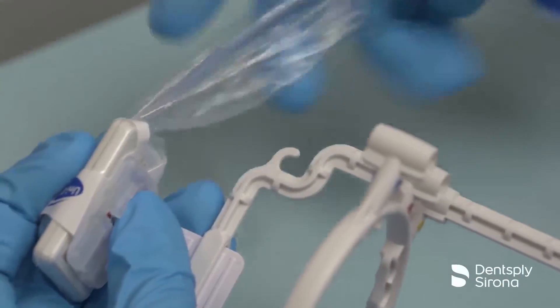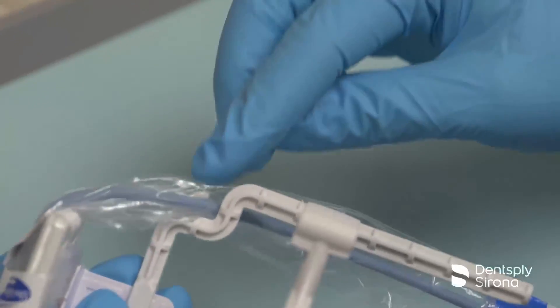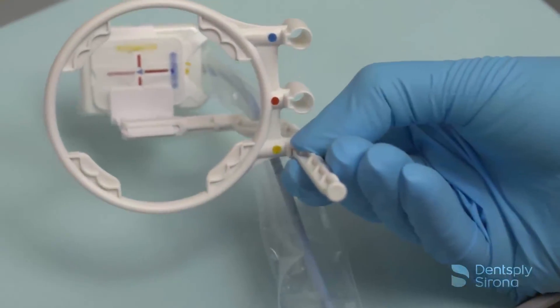The Unigrip arm and ring system offers a small hook feature to allow the clinician to rest the cord out of the way of the patient's bite, preventing cord drag.